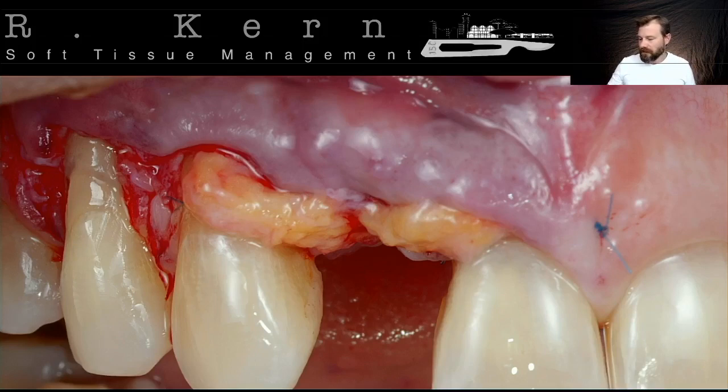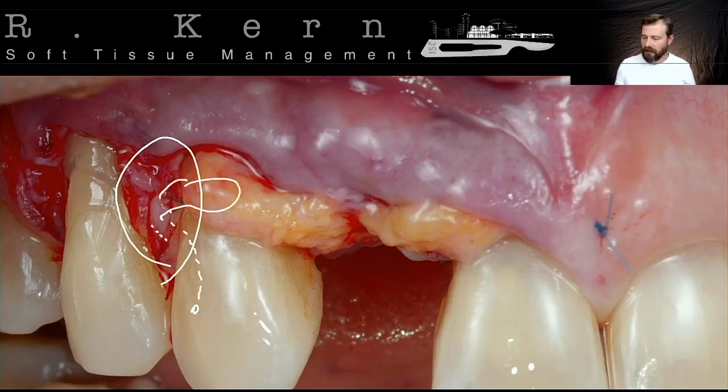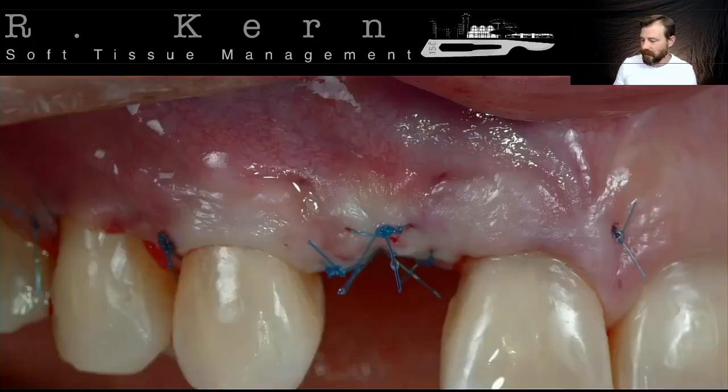Okay, here there's not good anchorage on this area. If I try to catch the periosteum, the papilla here, when I tie the knot, it's just going to break away, okay? So we start the sutures from the palate. We engage under the papilla, emerge here, engage the pediculum, and return again on the palate. So the papilla itself, from the buccal side to the palatal side, is being used as the anchorage to drag this bifid border of the pediculum to the distal margin. After that it is regular stuff.